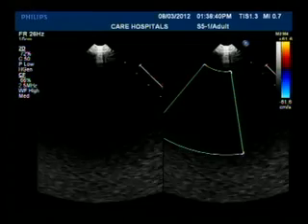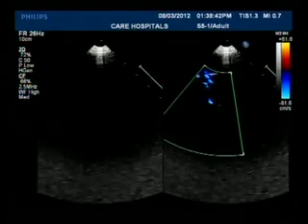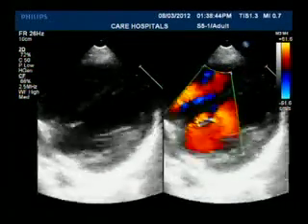If you pull the sheath, what will happen? The device will be across the aortic valve. Yes. So just show the echo now. Can you do a cine, Nagesh, because your fluoroscopy images are very poor.